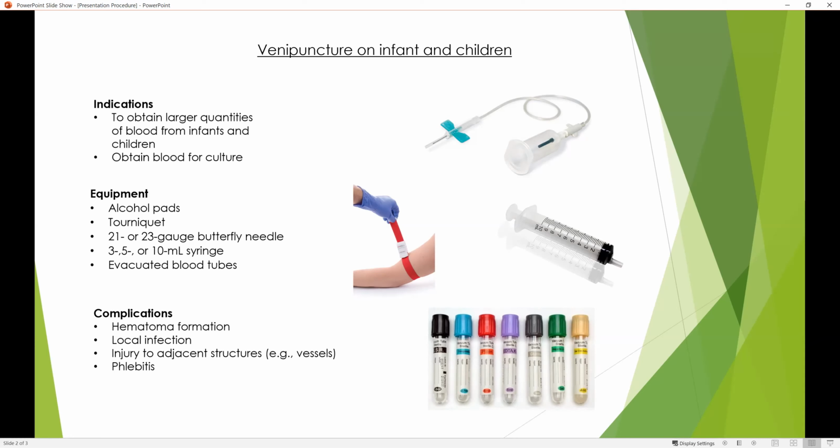So I would like you to re-present this topic to us and your colleagues, the method that we are using. You can show us the options, but the method that we actually use in Malaysia is the drop method, especially in pediatrics, rather than this closed method using a vacuum. Faham tak?